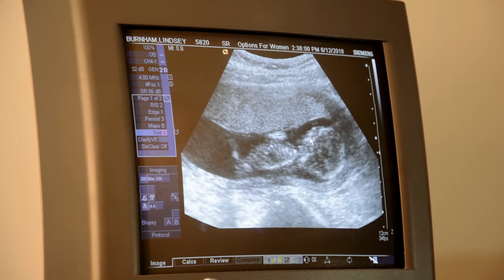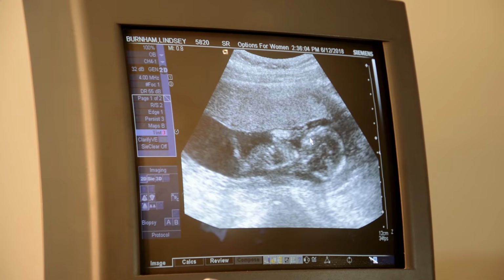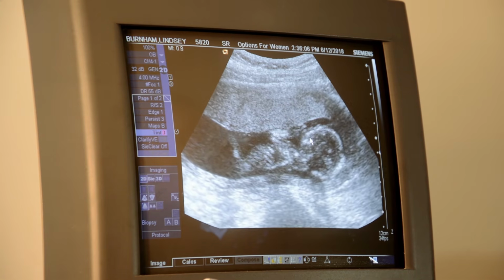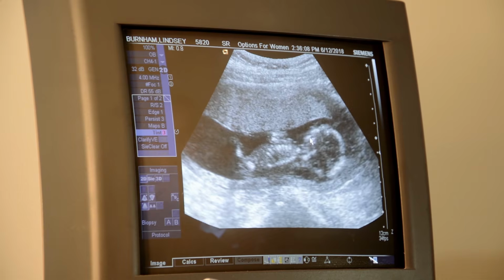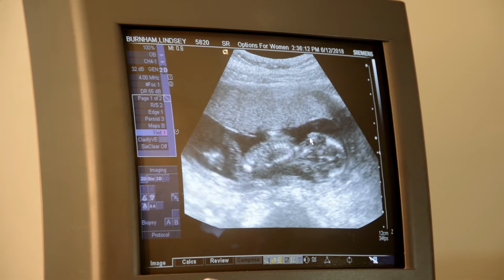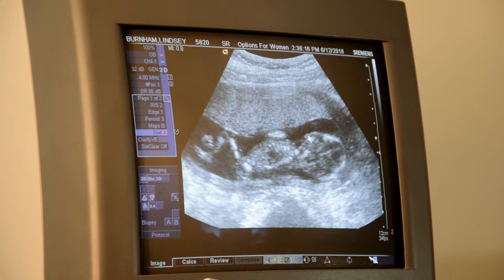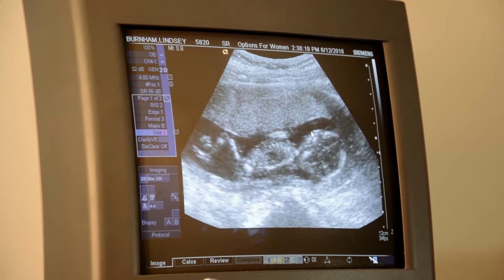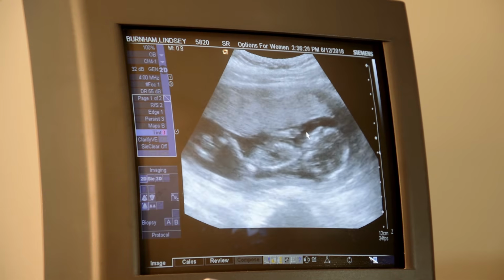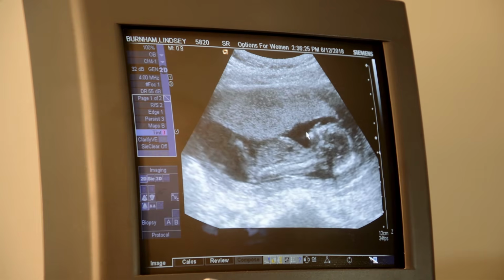Yeah, he did. Hiccuped or something. I don't know. It just looked like it. Almost, can you see him sucking on his tongue? Oh, look at that. Is that movement you can see? And see those little ribs, his legs. Is that an ear right there? I don't know. It could be. I see his little toes, his feet were crossed. Oh, he just kind of shook his feet a little bit.